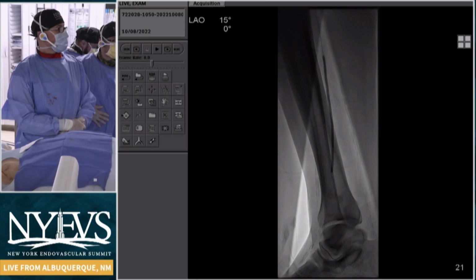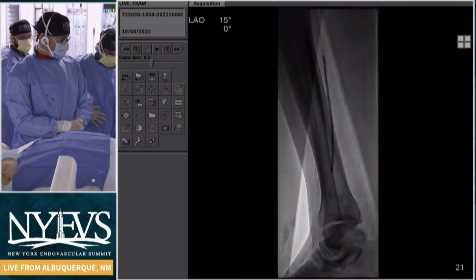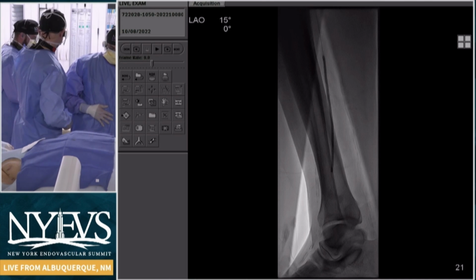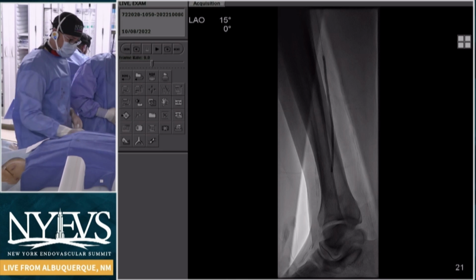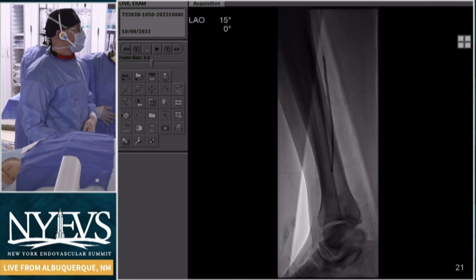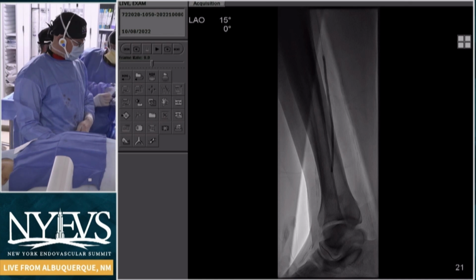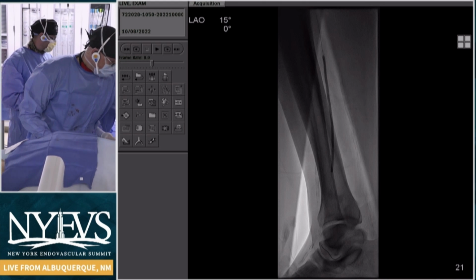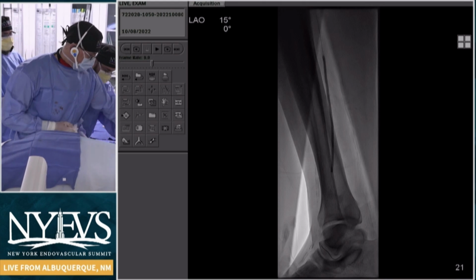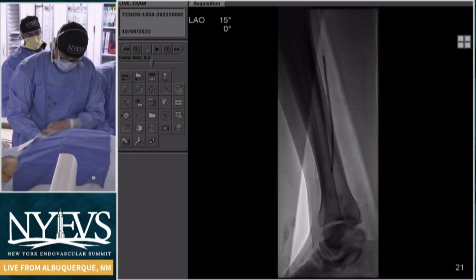The big issue too is, we see this even doing a bypass. You do a femoral peroneal bypass, and you check signals as soon as you're done. As soon as you've done the anastomosis, the signals are not great. You check on them the next day, and they've got a palpable DP and posterior tibial. Not a bounding, but you can actually palpate it. So I think it takes some time for those vessels to dilate up, and that's one of the challenges with doing perfusion studies in the operating room. Sometimes that interpretation takes time for those vessels to plump up.